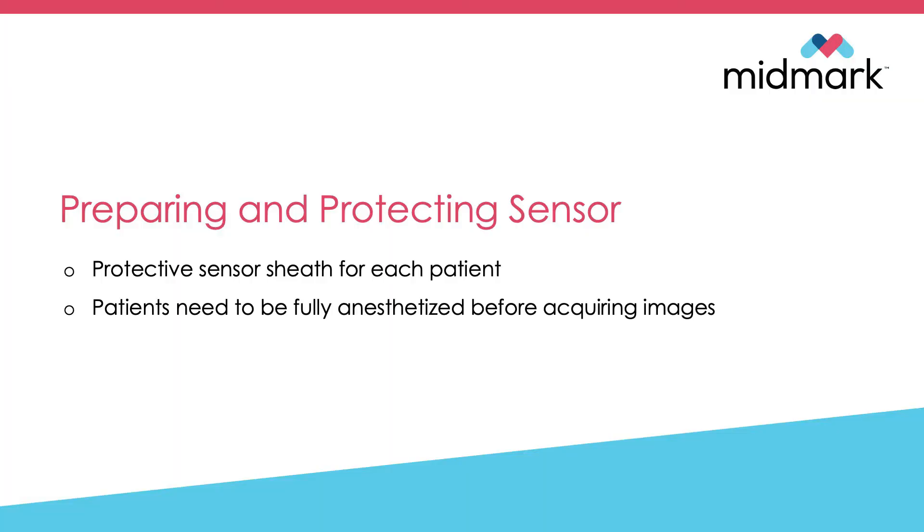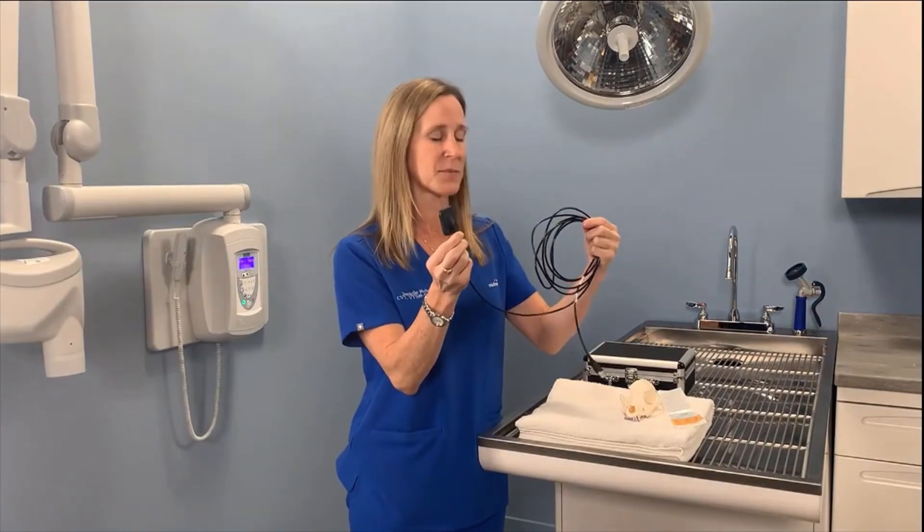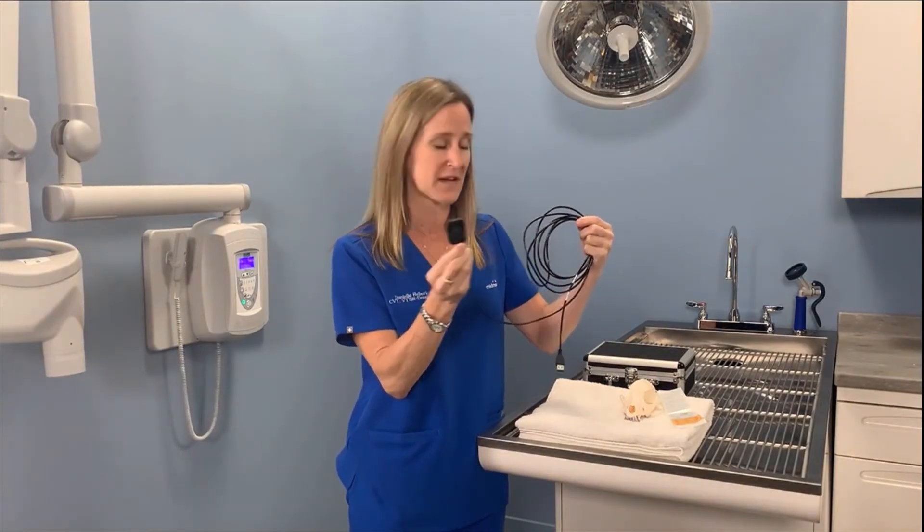Now we'll talk about how to prepare and protect your sensor. Each patient gets a new protective sheath. It's very important that patients are on a surgical plane of anesthesia before acquiring your x-ray images. This is the sensor you will be getting in your hospitals — it is a three meter cable sensor.